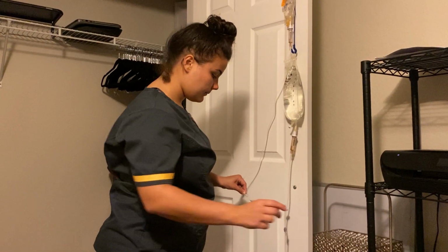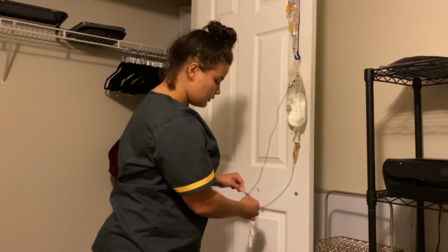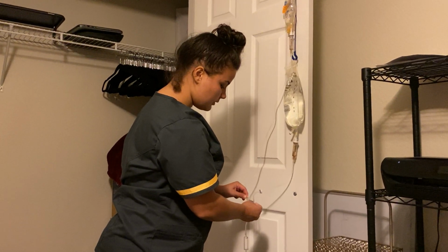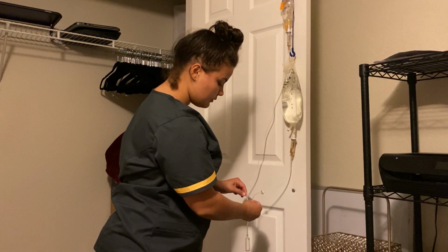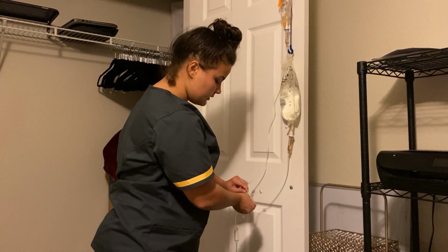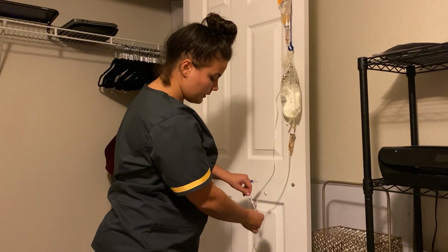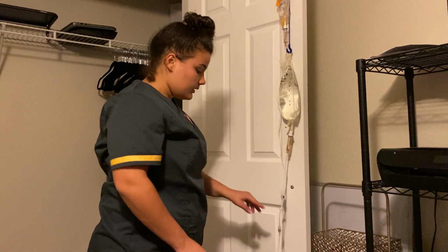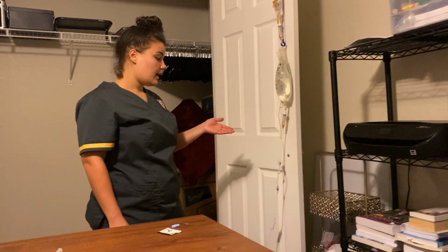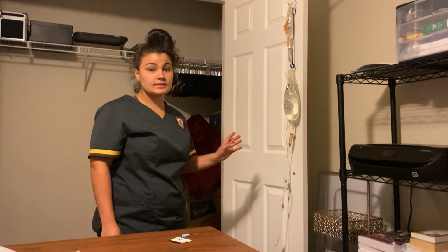I'm going to set that there. I'm going to get this port of my primary tubing, and you have to maintain sterility. What you have to do is push it in there and twist it, to where it's on there all the way. All right. Now, once I put it in there and put that up, everything is done.